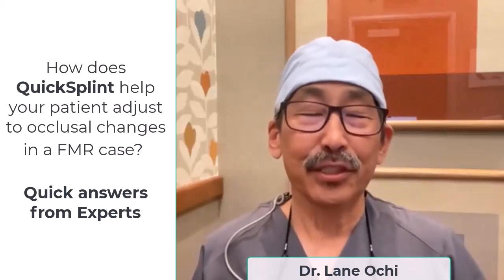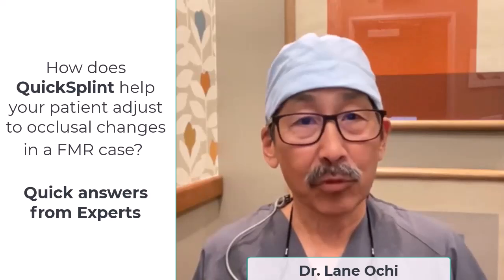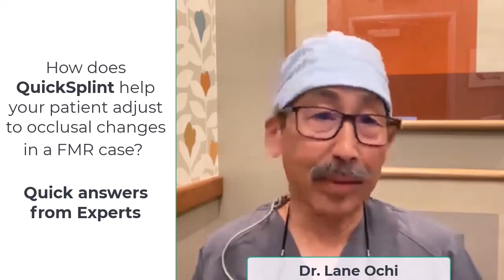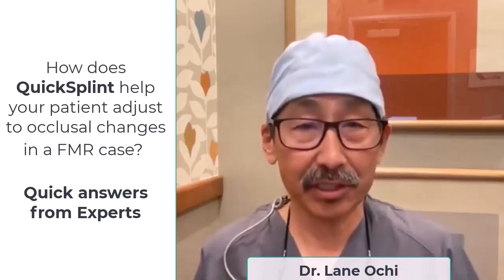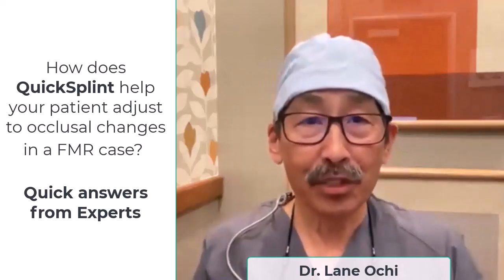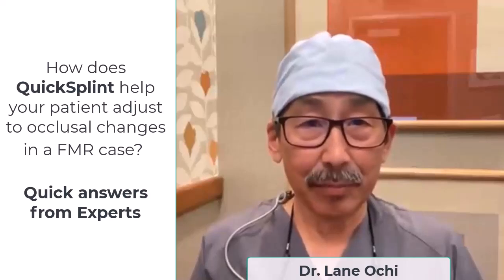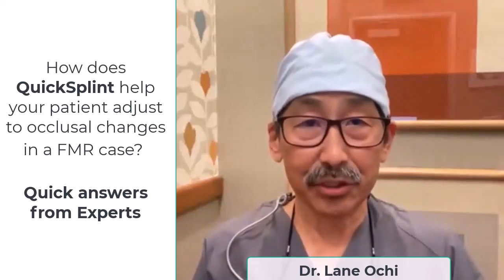The QuickSplint is one of the most important tools when doing a full mouth reconstruction. First, we like to use it when the patient's in the provisional phase. That way we don't have to worry about provisionals breaking or popping off, especially if the anteriors are veneers. The nice thing about that is that it allows more muscle settling and relaxation. So when it comes time to deliver the final case, we can be assured that the patient is in an orthopedically stable and comfortable position.